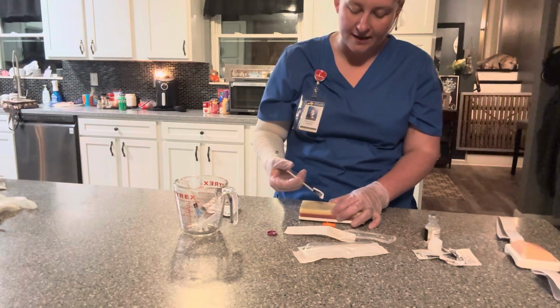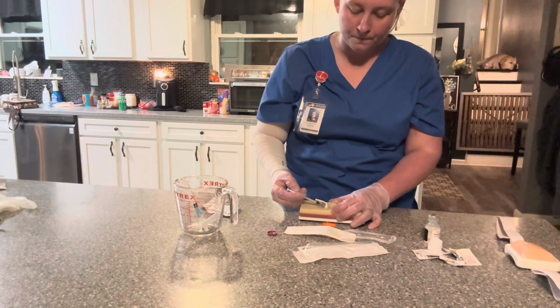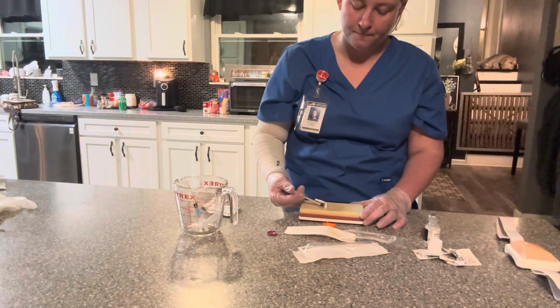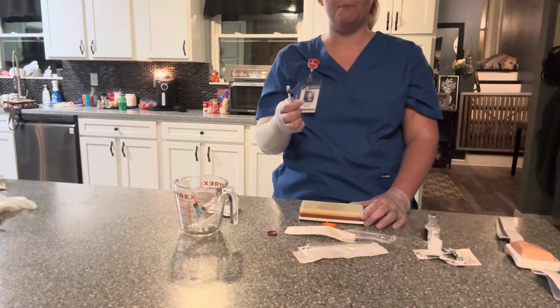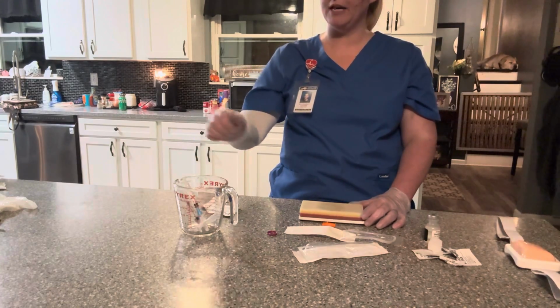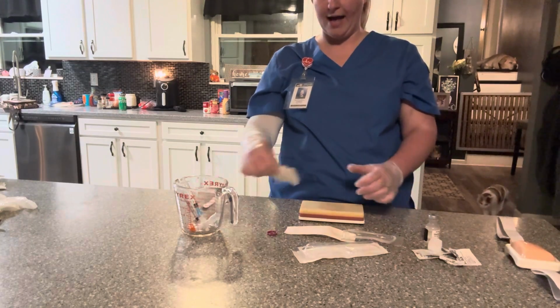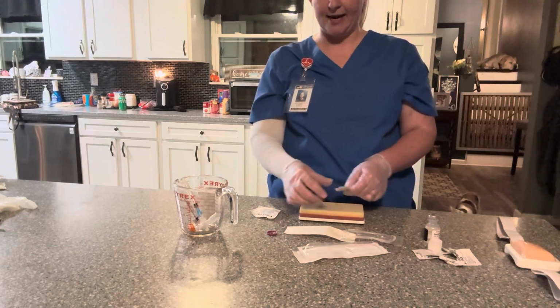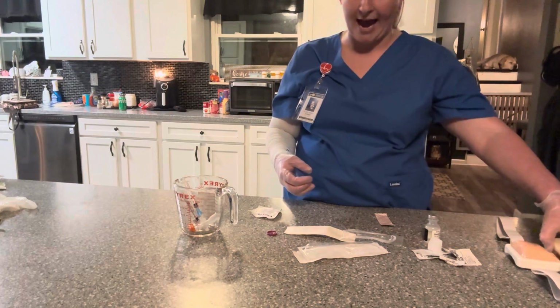I will pinch the skin, inject the needle at a 45-degree angle, inject the medication slowly, and pull out at a 45-degree angle. Before pulling out the needle, I will let go of the skin. I will dispose of my needle in the sharps container. I will wipe with a gauze, ensuring not to massage the area, and apply a Band-Aid. I will also monitor my patient for 10 to 15 minutes for any adverse reactions.